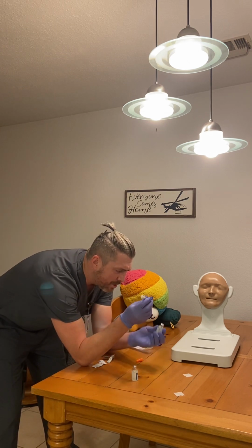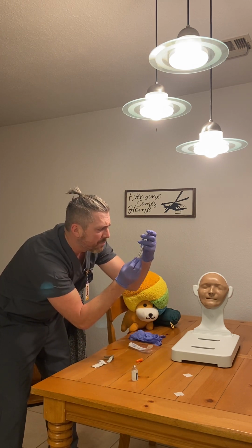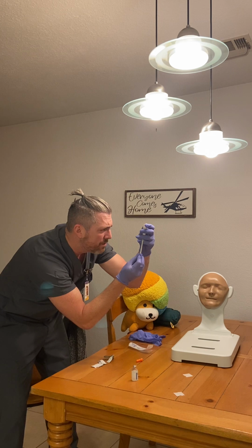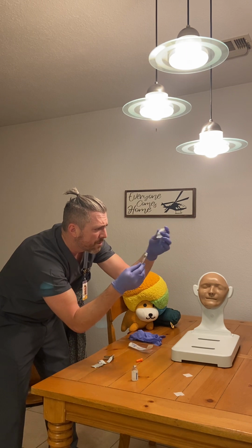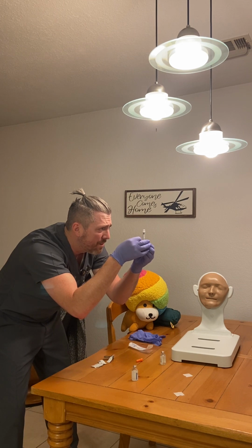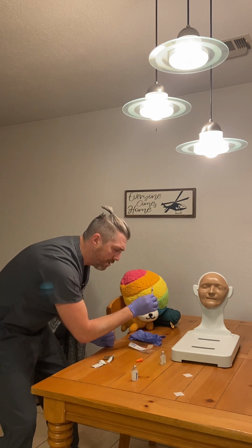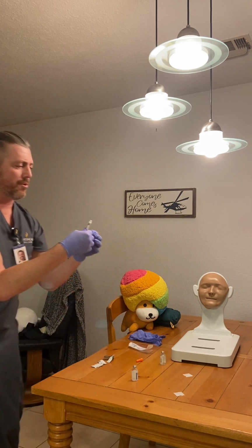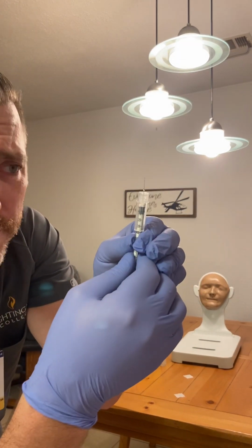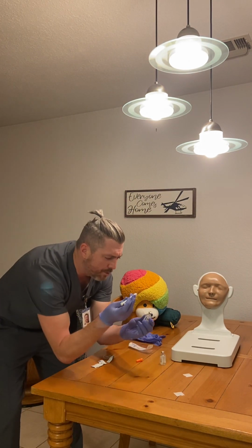And we're going to do this one and invert it. Invert it and draw up the 4 units. Remove it and tap it to get rid of any air. There we go. There's our 4 units of regular insulin. Checking with our nurse again. Verifying for the camera. And then now we're going to do it with our NPH.